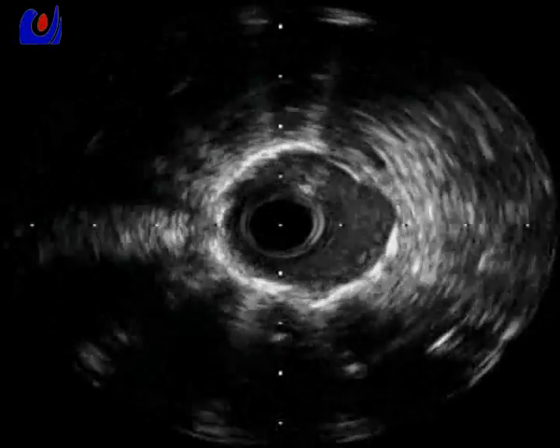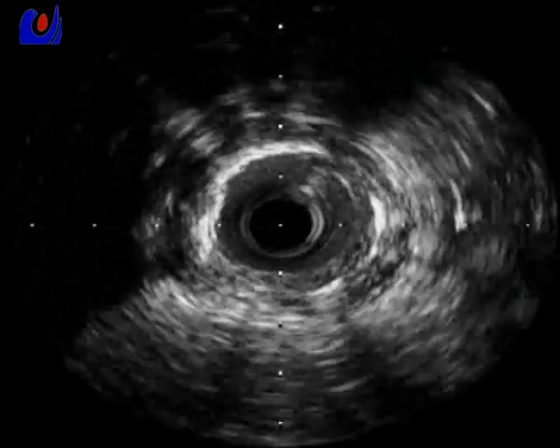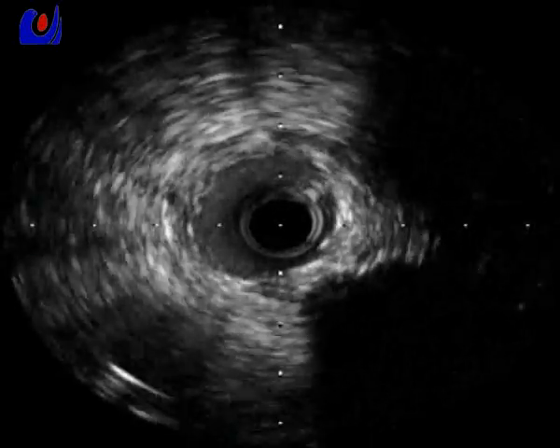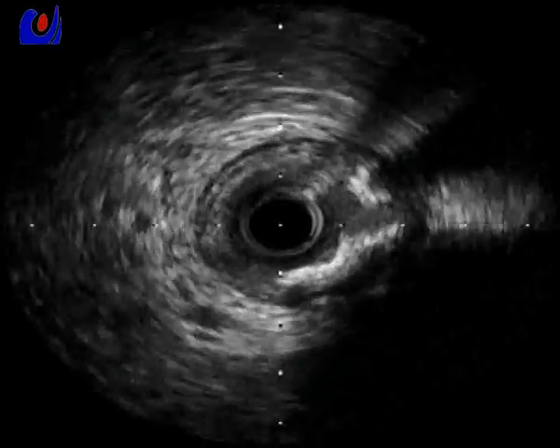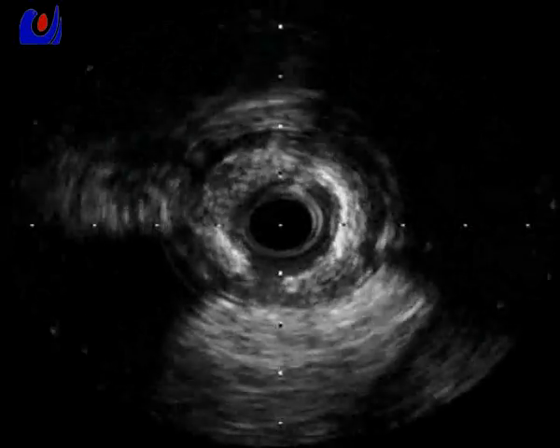But the distal reference I thought should be 2.5 compatible. We are using a 2.5 high pressure balloon up to 20 atmospheres for this tandem lesion. In between, proximal to the stent, we can see a lot of plaque. But the good thing is that we can see no ring-down calcification. Otherwise, we would probably have to switch to a rotablator.